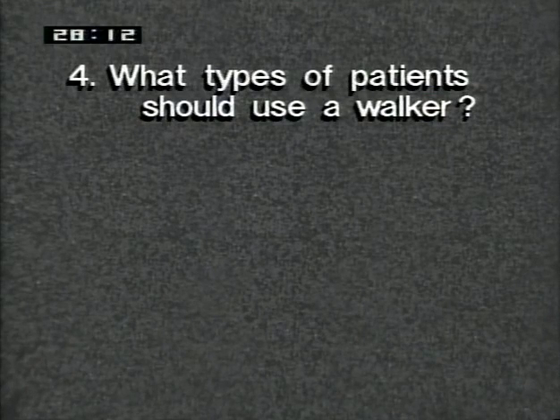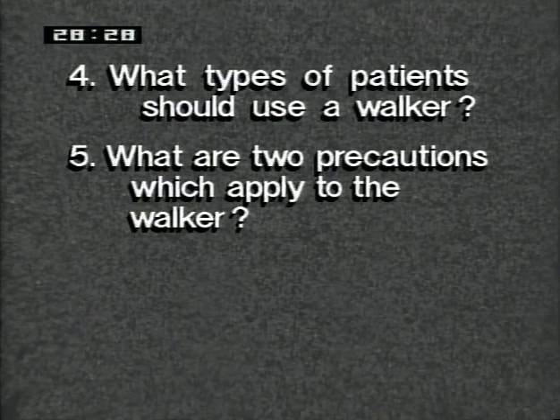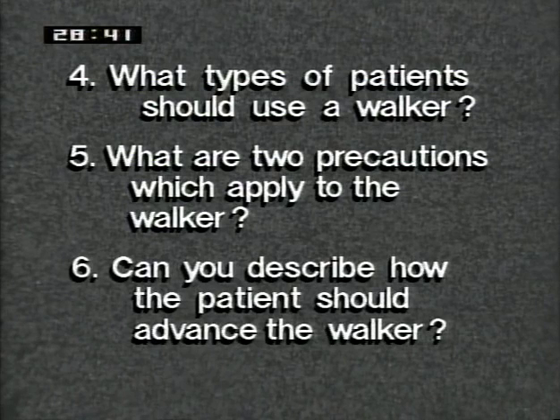What types of patients would use a walker? What are 2 precautions which apply to the walker? And can you describe how the patient should advance the walker?